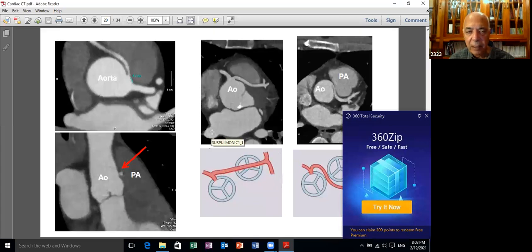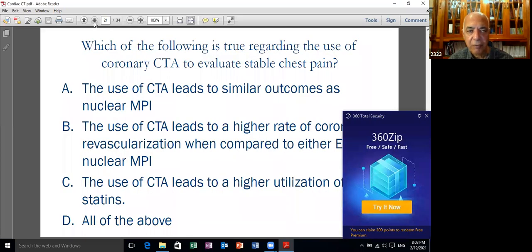unambiguously is the CT. So under these circumstances, you will get the picture of the coronary artery located between the outflow tract of the right ventricle here. And you don't need to differentiate between whether it's going intramurally or extramurally. Both of them need some form of complex surgery to get this coronary artery outside it and implant it in the appropriate sinus of Valsalva. So the gold standard for this kind of anomaly is CT angiography.